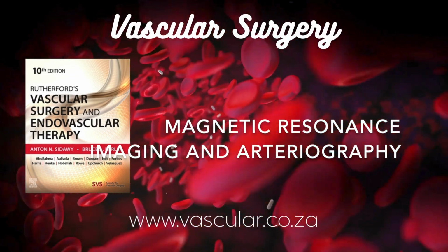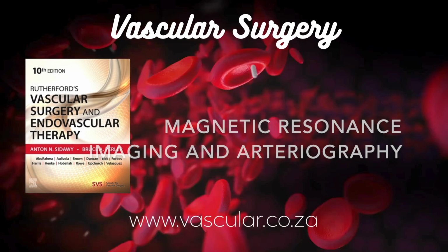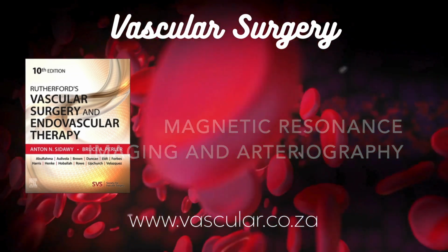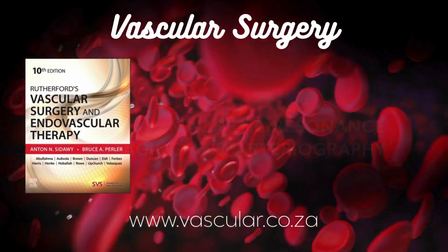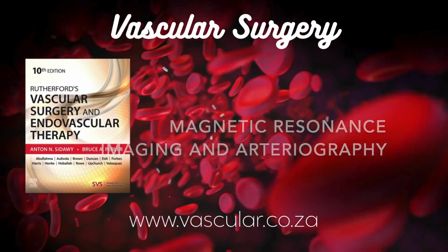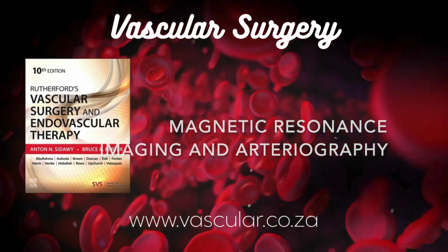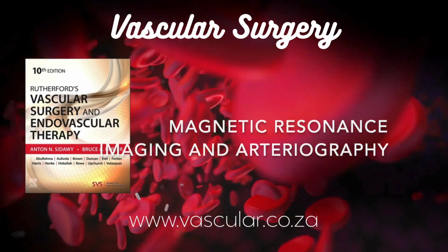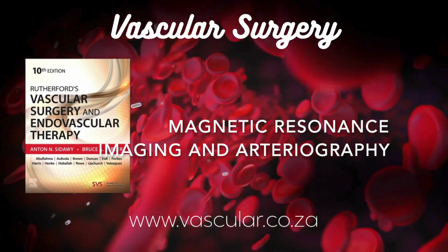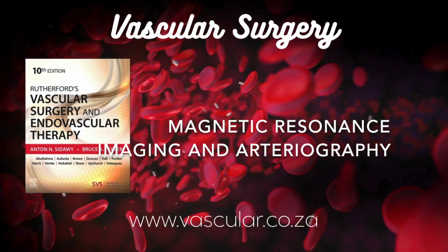Okay, let's try to synthesize this. Key takeaways from our deep dive into MRA. We've gone through the underlying physics, the different ways it's done with and without contrast, looked at its huge range of uses from aorta to foot, arteries, and veins. And importantly, discussed the artifacts, risks like NSF, and contraindications like certain pacemakers. So for you, the listener, you should now have a much better feel for how MRA gives us these incredible views inside blood vessels, its specific strengths, and also where it fits alongside other tools like CTA.